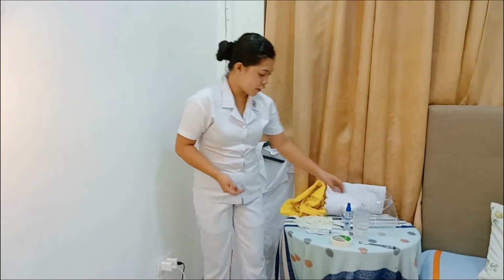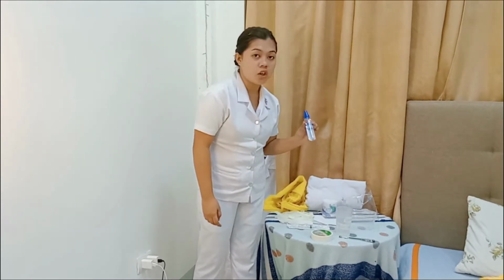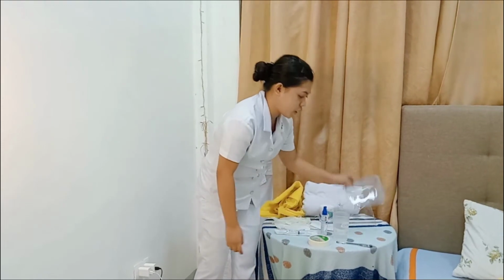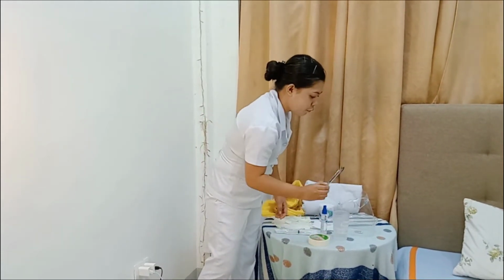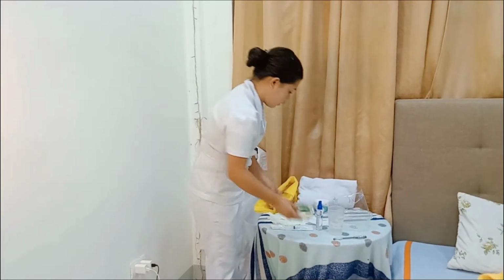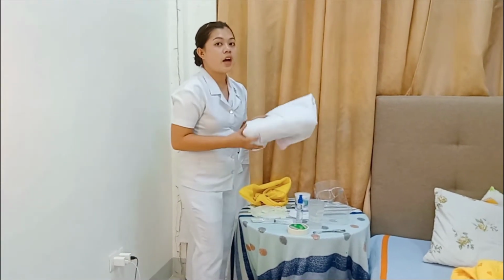Next is to gather appropriate supplies. Organizing of equipment promotes time management. We have here our normal saline solution. We also have our alcohol and our syringe. This will serve as our kidney basin, our improvised dressing, our ball pen for documentation later on, and our tape. Next, we also have our waterproof underpads.